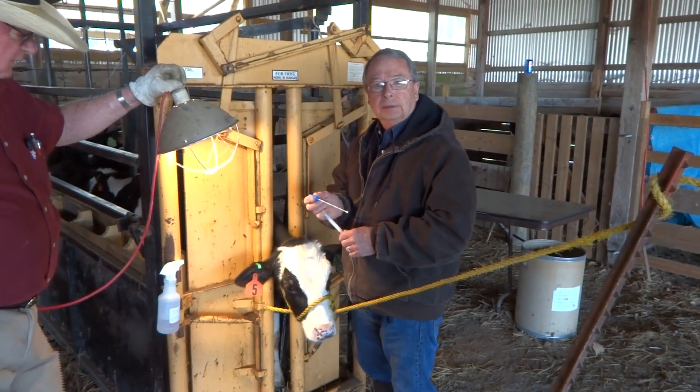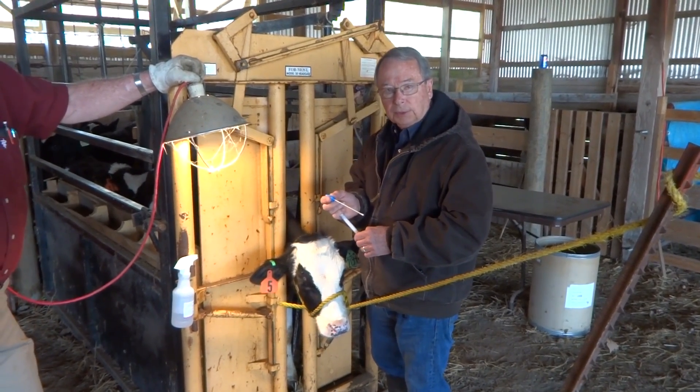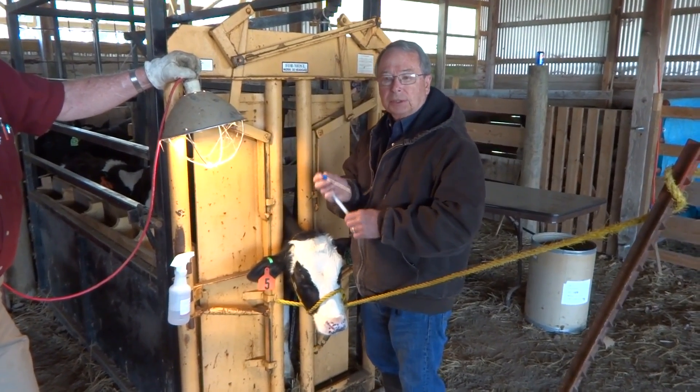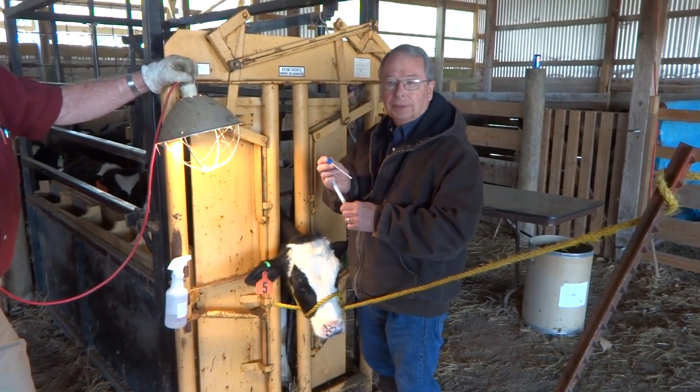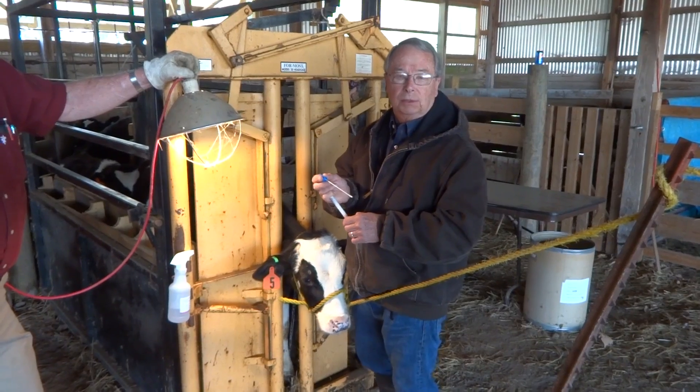I'm going to gently rotate the swab under the lower eyelid and saturate it with lacrimal fluid. Some people suggest trying to get right between an ulcer and the margin of that ulcer, but the way these calves roll their eyes, that's next to impossible.